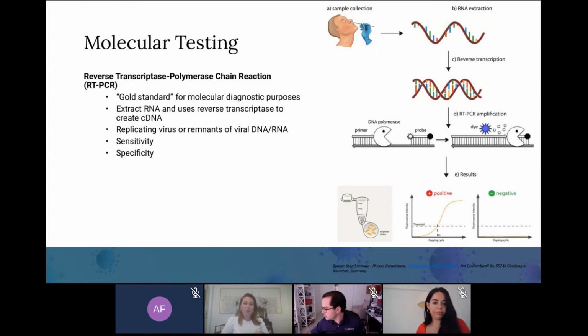So the specificity for RT-PCR tests is quite high because the primer design is specific to the genome sequence of SARS-CoV-2 and increases when the test uses detection to maybe more than one target site on the virus itself. Limit of detection for RT-PCR tests will tell you the minimum amount of RNA that a test will need to detect virus 95% of the time. So the limit of detection, therefore, provides a sort of an overall sensitivity of the test and varies really depending on the commercial manufacturer, the type of specimen they submitted, such as saliva or nasal swabs. The good news here is that most RT-PCR tests allow them to detect at least early infection. That is, obviously, if the sample's collected properly and isn't compromised.